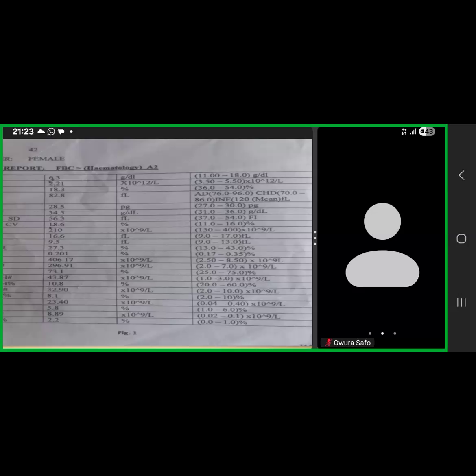Assuming it's a true reflection of what is going on, what would you expect to see on peripheral blood so that it validates the full blood count, and says yes, the full blood count is correct? What generally would you see for red cells, for example? What would you see for the white cells? And what would you see for the platelets?